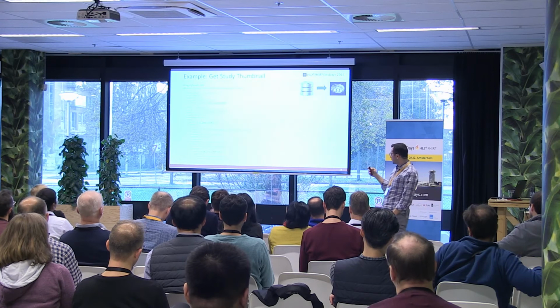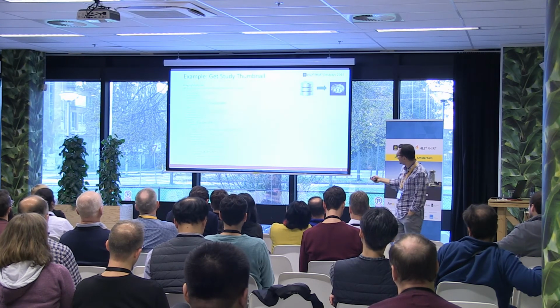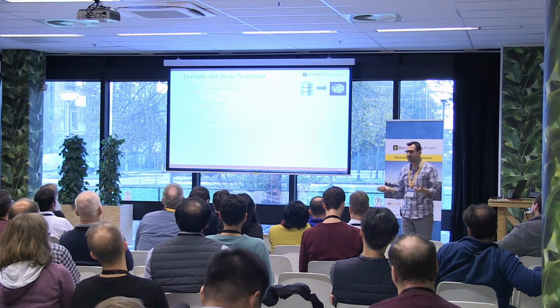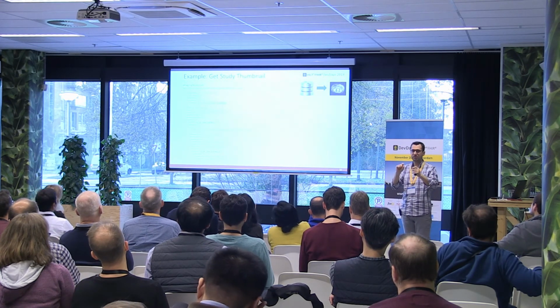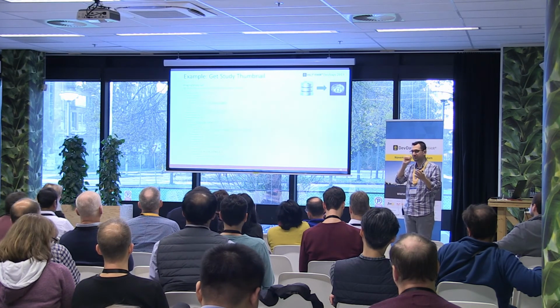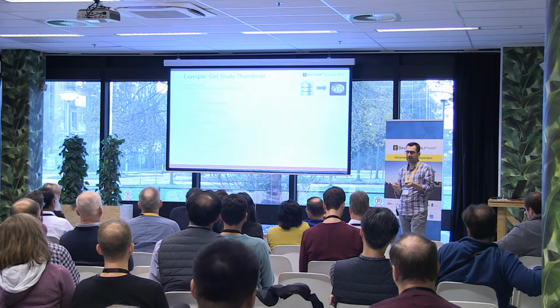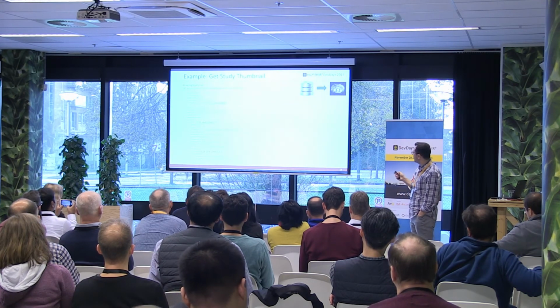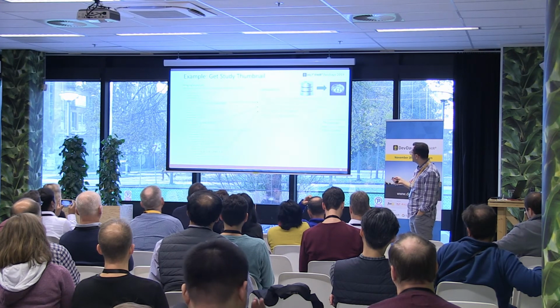All right, so another one we have is being able to get a thumbnail of the study. That could be another example where you could request an image and show it, just because maybe you have a client and you want to be able to show useful thumbnails instead of just a plain, boring list. So that could be a useful example. Now, there is more talk about thumbnails, but we'll see if we have time.